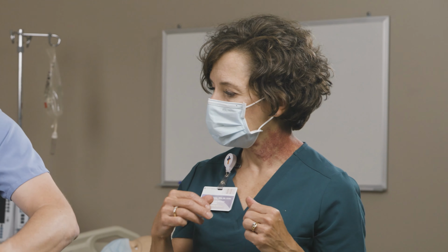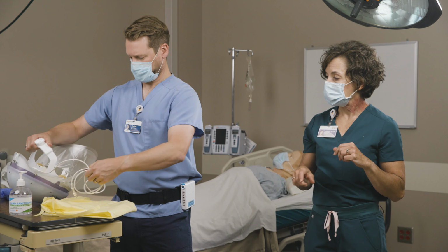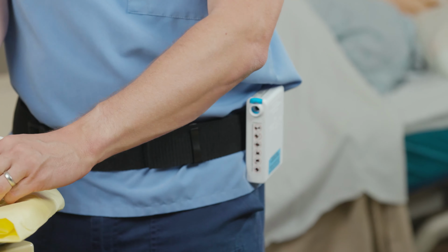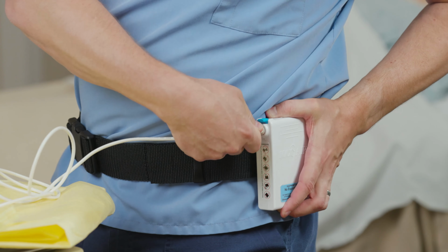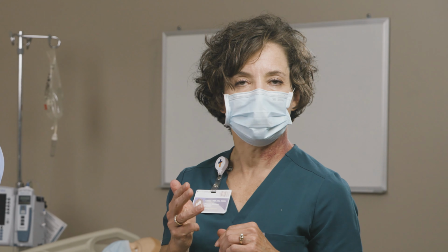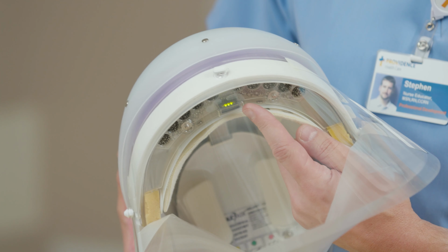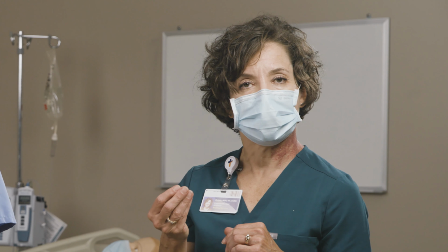Okay, now he's going to proceed with plugging the CAPR into the battery pack. And when you plug the CAPR in, you want to make sure that all 5 lights turn on. There should be 3 green lights, 1 red light, and 1 yellow light. The red and the yellow light should turn off after a few seconds, and the green lights indicate your battery life.